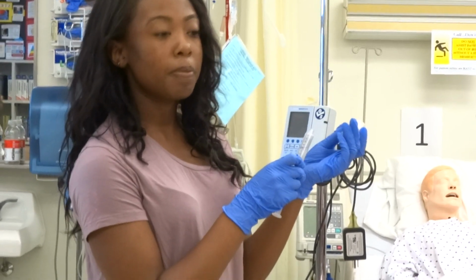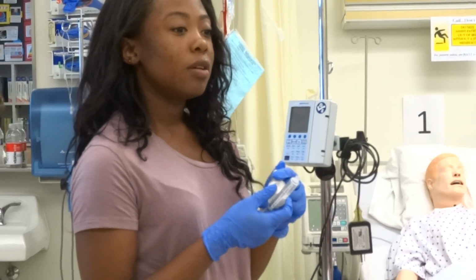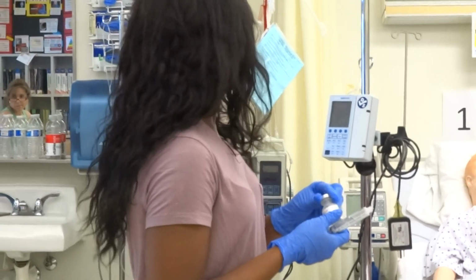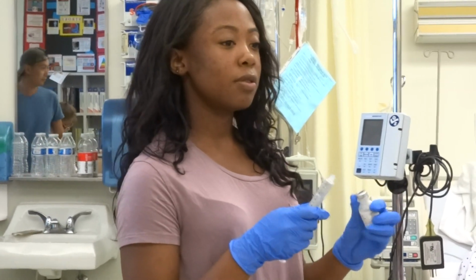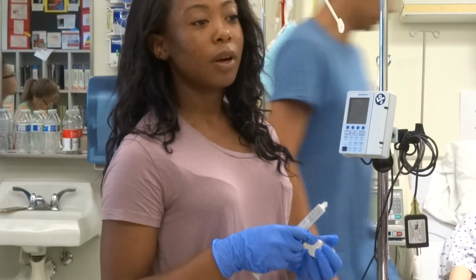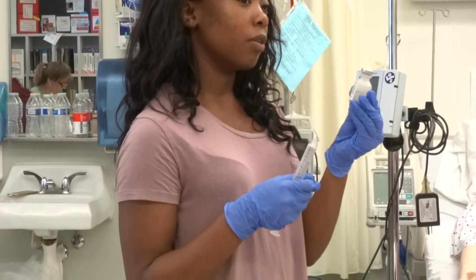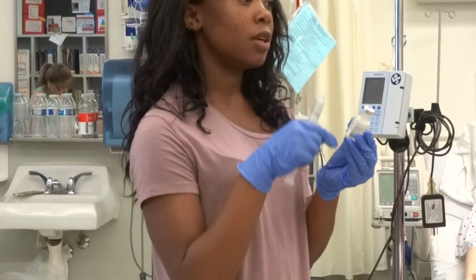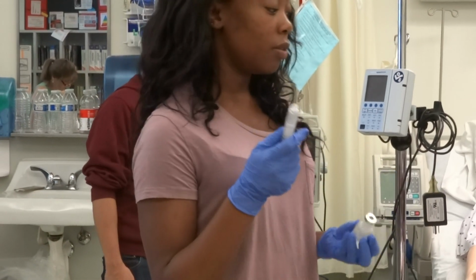Is that like a one-time use container? It is. It's not like the others where there's multiple dosages in one, like an insulin or something that's left in the med room and everyone can use, because once you reconstitute it, you don't know how much is in there. Usually they're 40 milligrams in a Protonix bottle, so 40 milligrams is within that powder. So 10 mLs, you're gonna pull that all out.